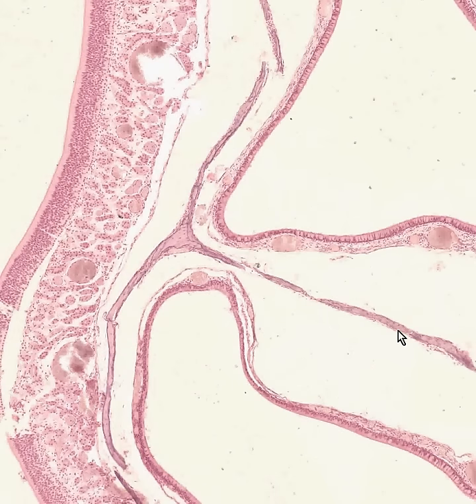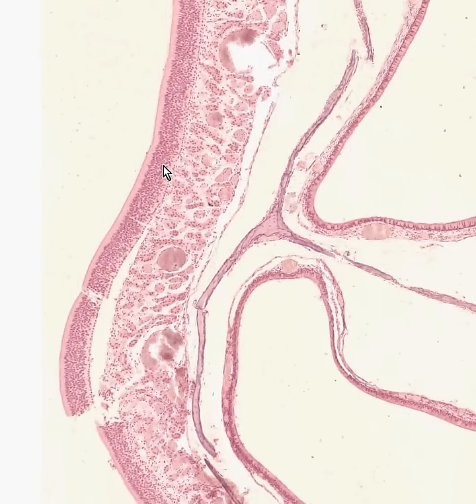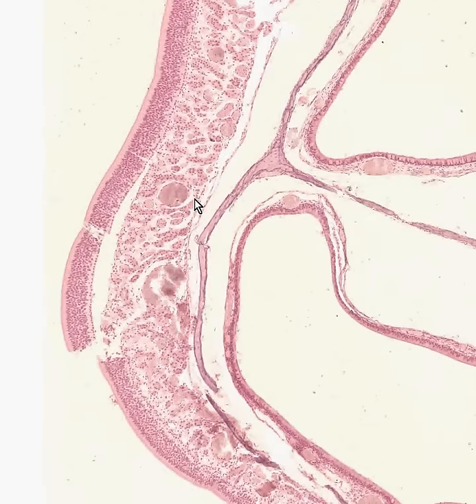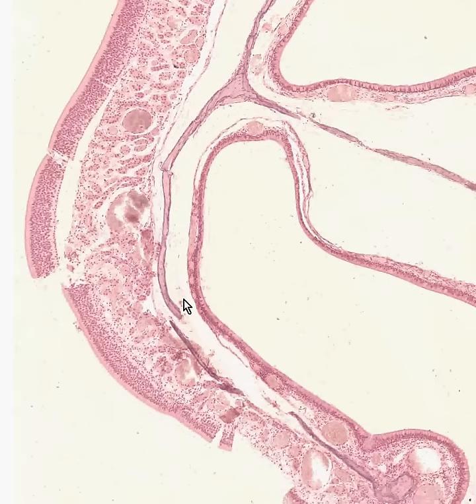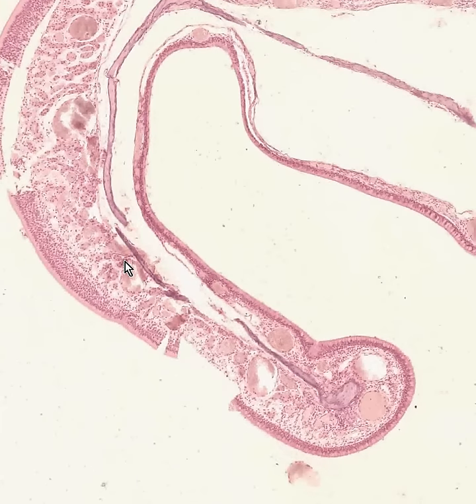Look how thin the bone can be. Look how nice and typical this pseudo-stratified ciliated columnar epithelium is. Look how very rich the underlying connective tissue is with veins in order to warm the air that travels through this cavity. And notice the general structure of the specialized olfactory epithelium, which will be sending out nerve fibers, which will eventually pierce the cribriform plate to travel to the olfactory bulb. Thank you very much.